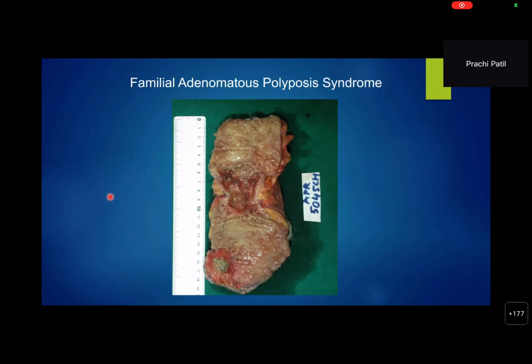Yes. And one more pitfall in the diagnosis of hamartomatous polyps, especially PJ, is that if it is a smaller polyp, we may not see these typical morphologic features. So it's always better, and that is what you do as well, to get the biggest of the polyps, because that is the one likely to show the full-blown branching tree-like appearance. Smaller polyps may not have them. So it is one of the difficulties that we face in diagnosis.